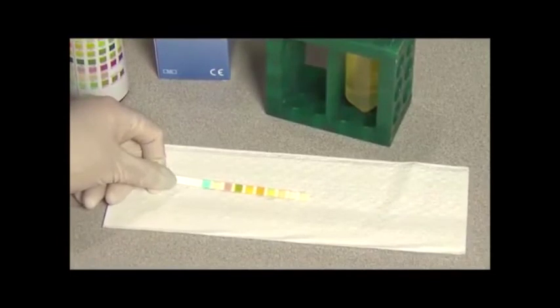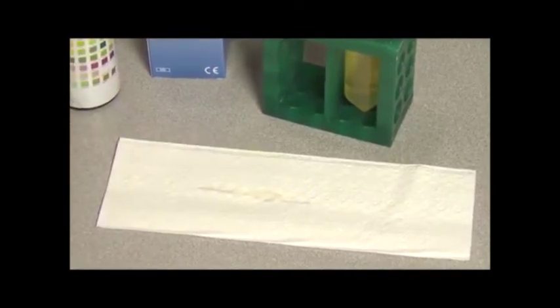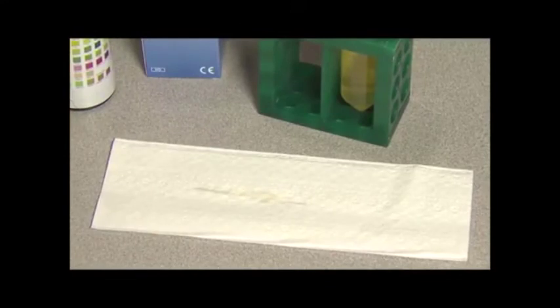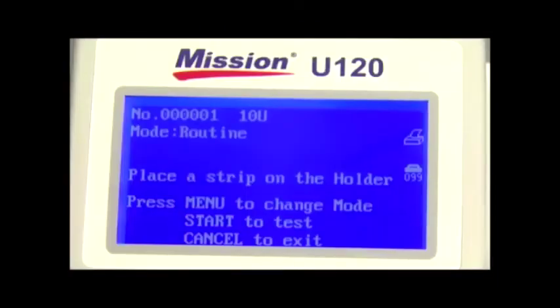Touch the edge of the strip to absorbent paper to avoid mixing chemicals from one pad to another and soiling hands with urine. Place the strip with the reagent area facing upwards onto the strip holder.